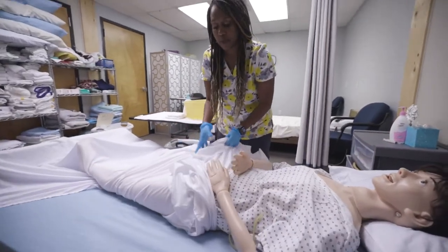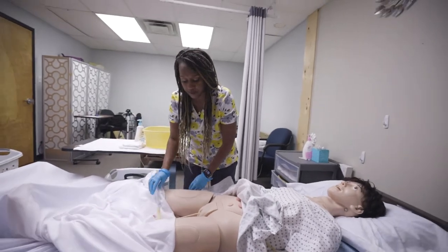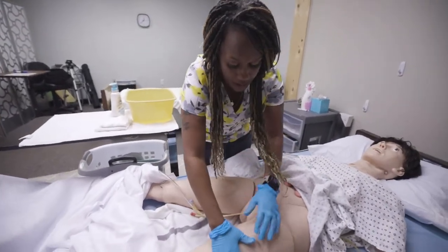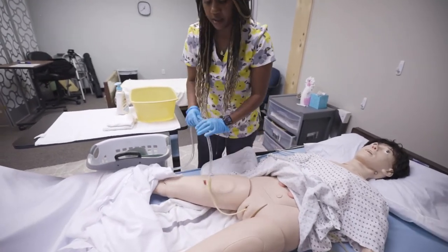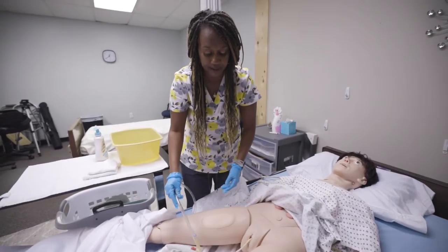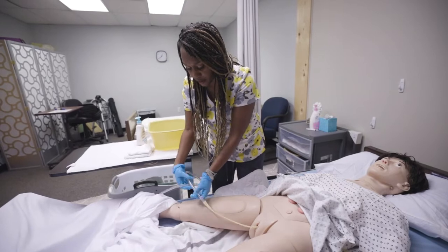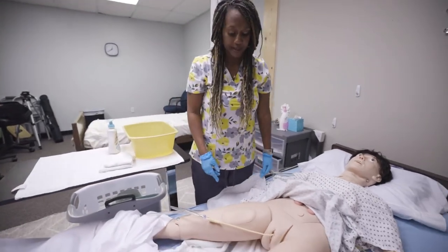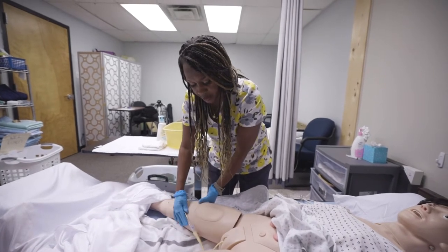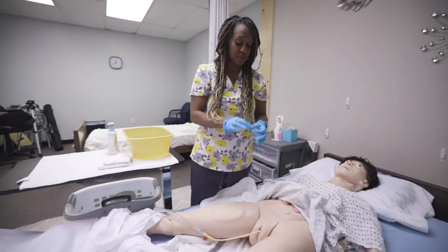Now we need to expose the patient just a little bit — I call this 'sheet to feet' — bring the sheet down and pull the gown up. We have a catheter here with a barrier and dry towel, so we're good. The catheter should always go over the leg. If the bag is not draining, make sure it's not kinked — kinks happen especially when you put on pants and don't check the line. Put it over the leg, never under, and make a little loop on the bed so it's not tugging. For elderly patients, use a leg strap rather than tape to prevent the catheter from pulling out.